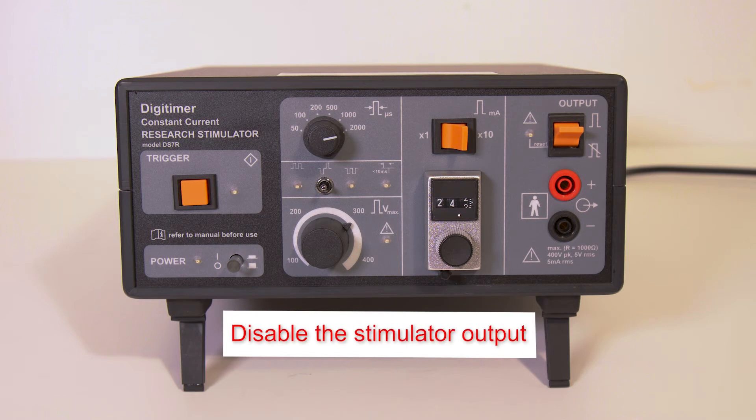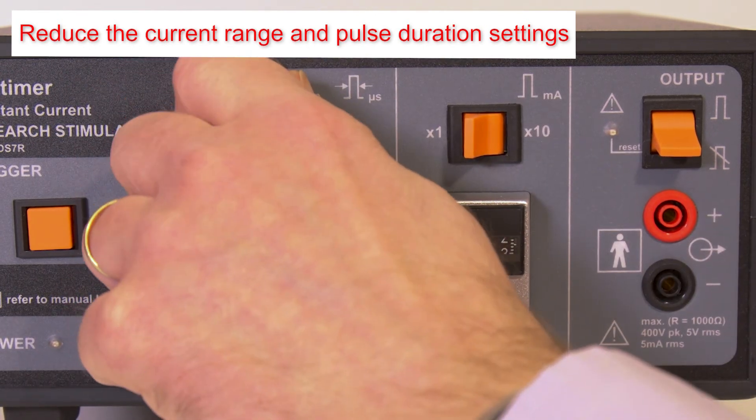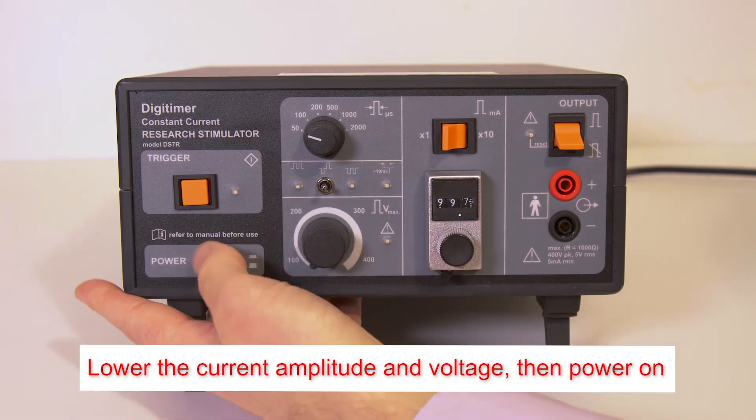Check and disable the stimulator output using the orange toggle switch. Check the current output range and set the pulse duration to the shortest option. Reduce the current amplitude and voltage, then turn the power on.